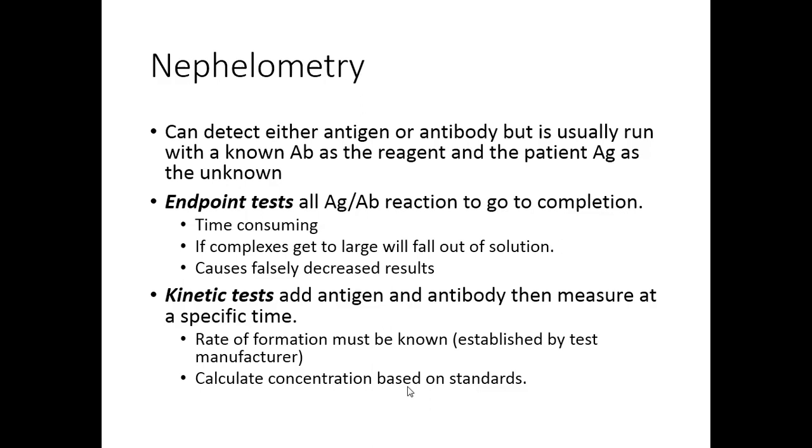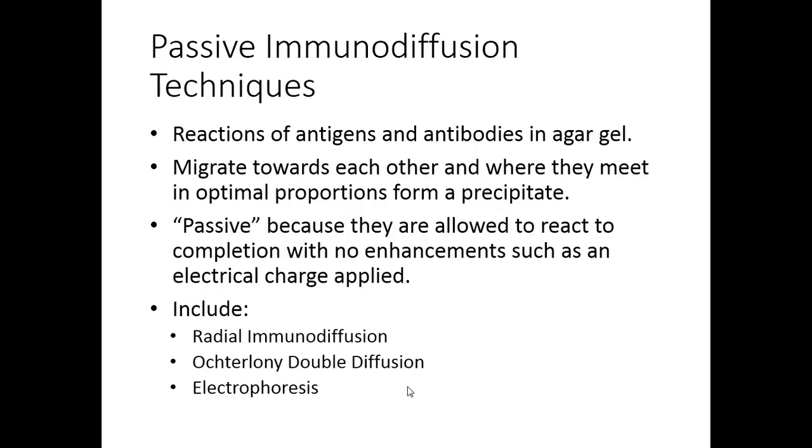It's usually a little bit less than a day. 19-20 hours is pretty standard for these kinetic tests. So better than 3 days, I suppose, but not much more. So those are the two versions of nephelometric tests that we have seen.